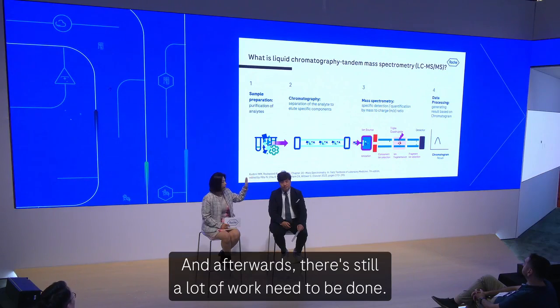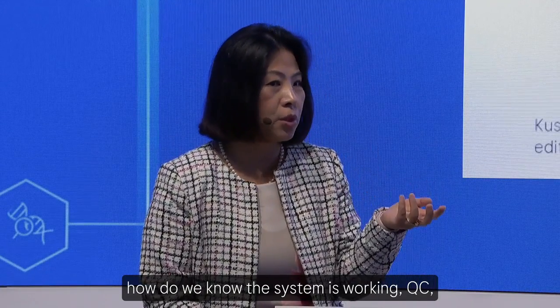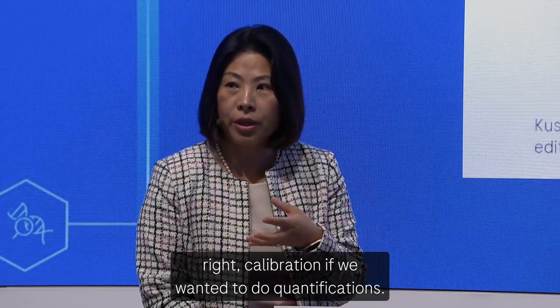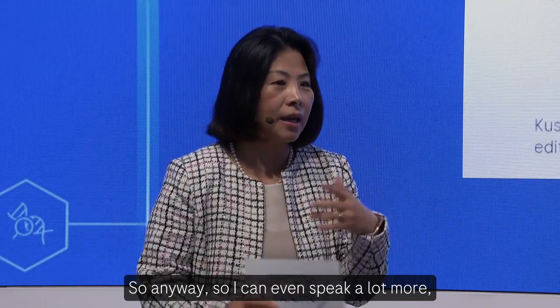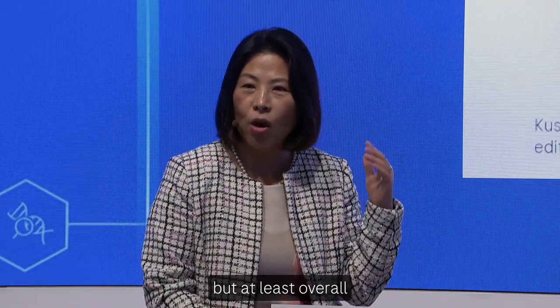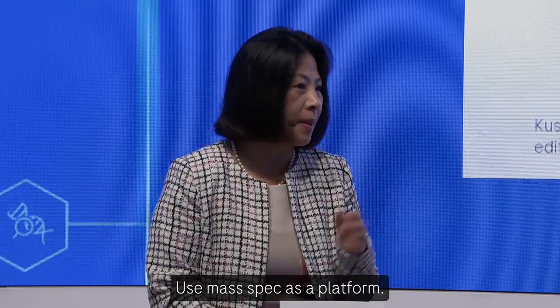Afterwards, there's still a lot of work to be done: peak integration, QC to know the system is working, and calibration if we want to do quantification. I could speak a lot more, but overall this is the workflow we have, using mass spec as a platform.